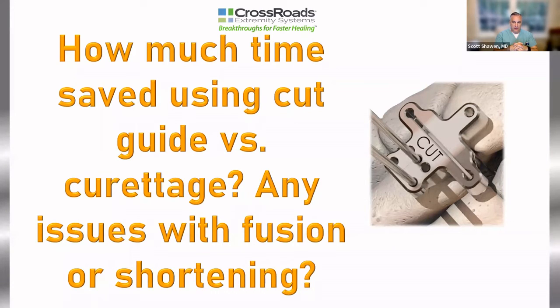The shortening, when I first did my freehand cuts, I was very worried about that. But I was able to relieve that if you have a problem by releasing some of the ligaments around the base of the metatarsal. And so I haven't seen that problem. And with the cut guides, you're taking even less than freehand cuts. So I don't really see that as an issue. I do remember the night that Mike and I were talking about this, and we were thinking we were going to have to put some sort of graft in between where you did your cut resection, but it's really not the case.